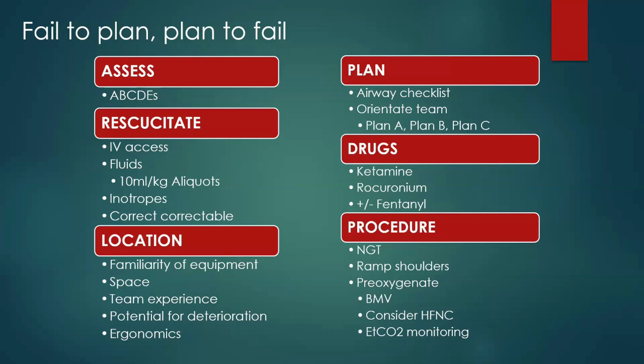Make sure that you have a space that can also deal with the potential for deterioration. To know that with this intubation, with this child that is critically unwell, that you might be faced with a situation where a cardiac arrest does happen, and you need to be prepped for that and able to respond to that also appropriately.